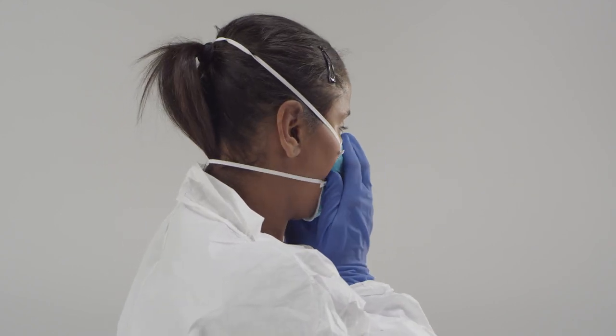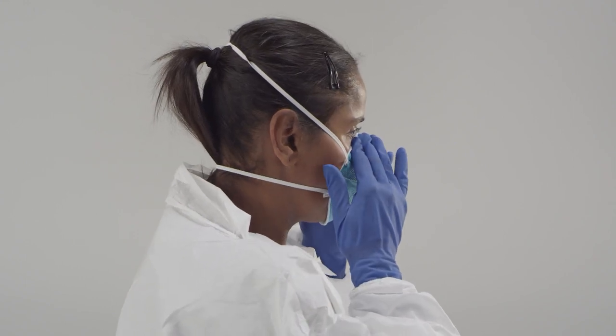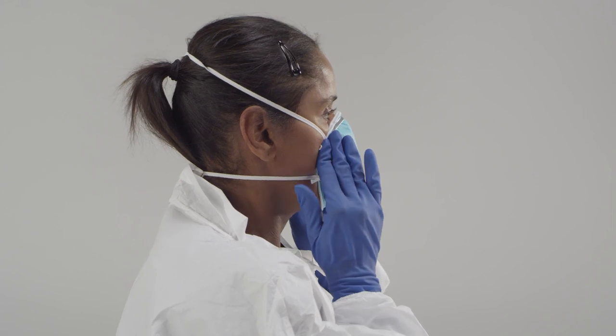Mold the nose piece of the respirator over the ridge of your nose to obtain a tight seal. Always follow the manufacturer's instructions for wearing a respirator. Perform a fit check to ensure there is a good seal against the skin.